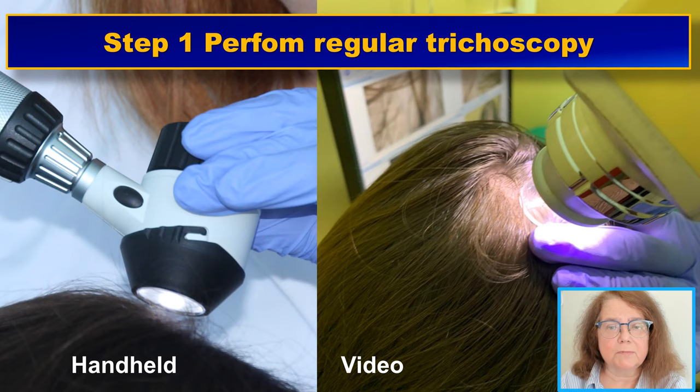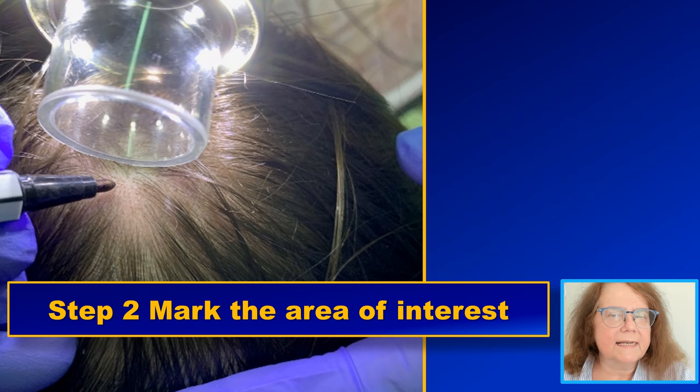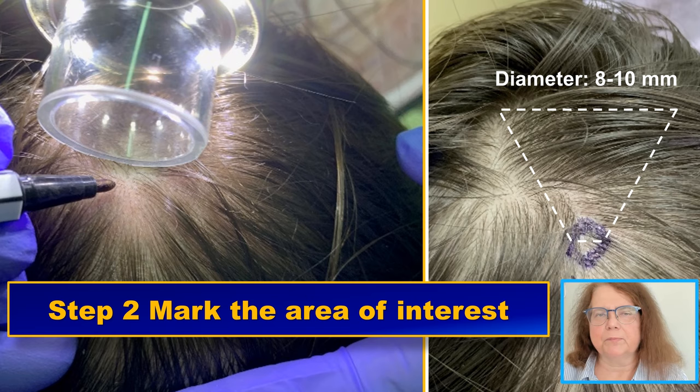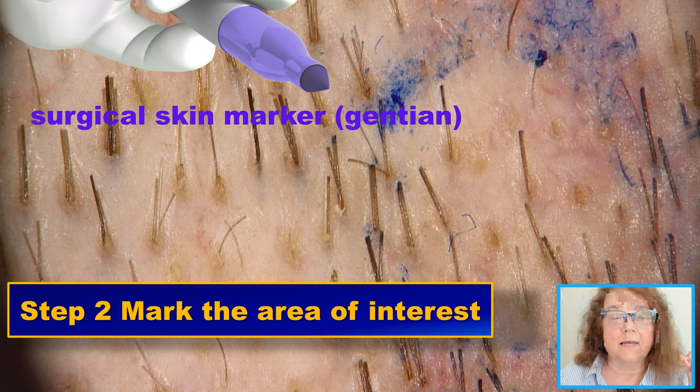How do we perform a trichoscopy guided biopsy? First, we perform a regular trichoscopy — we can do it either with a handheld or with a video dermoscope. The steps I'll be showing now will use a video dermoscope, but you can perform this exactly the same way with a handheld dermoscope. When we see a typical abnormality in the trichoscopy image, we mark a circle in the area where the abnormality is most abundant, and in most cases this is a circle of approximately 8 to 10 millimeters in diameter.